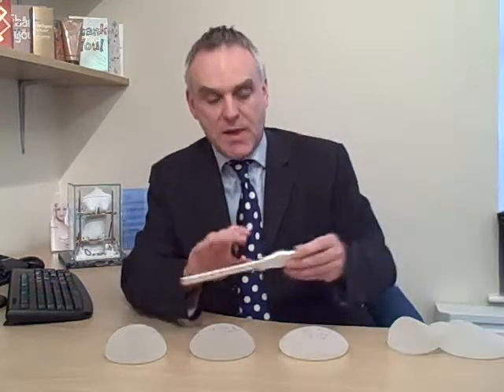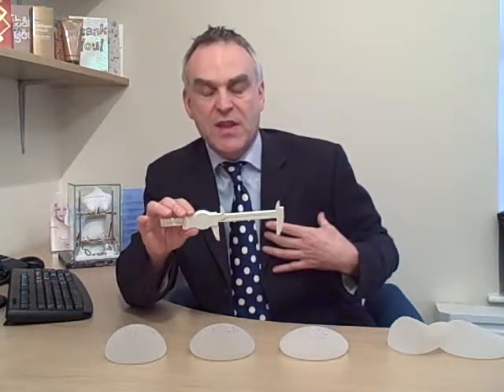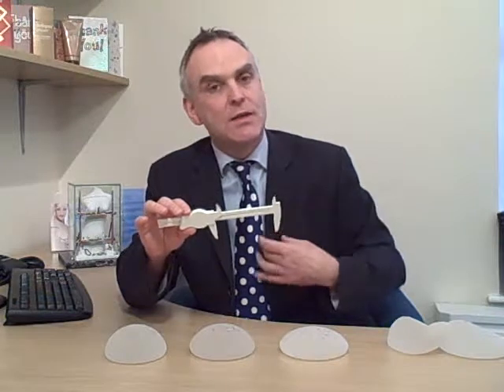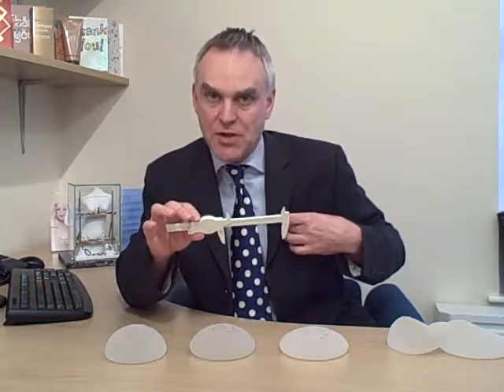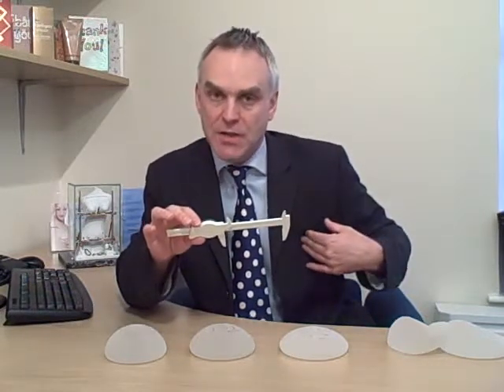Now how do you choose which one's best for you? Well, the basic thing is it depends on your chest dimensions. So what we do is we measure the base of your breast with our caliper. The base of your breast would typically be sort of 12 to 13 centimetres. We then minus your natural breast tissue, so that's using the pinch technique. So if your base is 13 centimetres, the pinch, which takes in 2 folds of skin, remember, so you can say that's from the inner and outer aspect, is 2 centimetres.